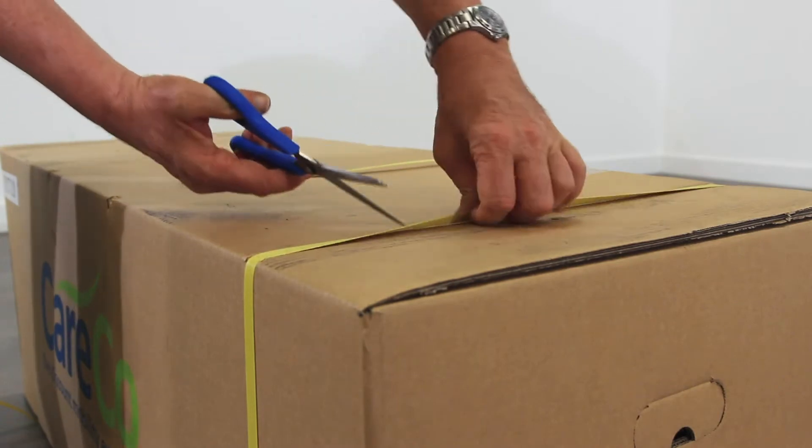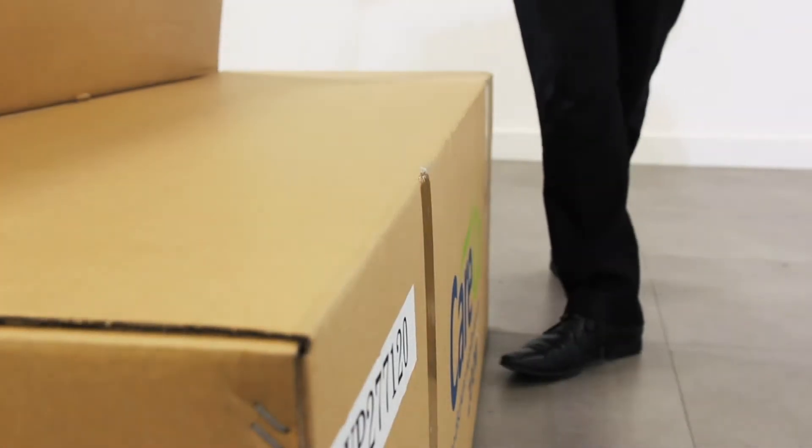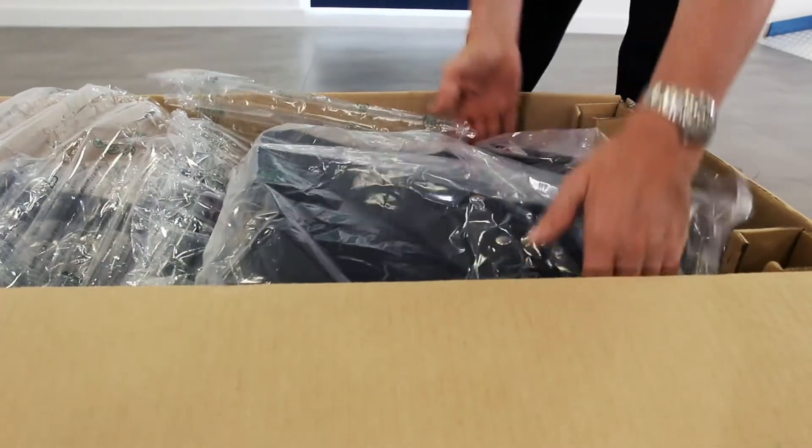To open the box, carefully cut the tape or any straps with a knife or a pair of scissors. Once opened, remove any excess packaging and set aside the seat.